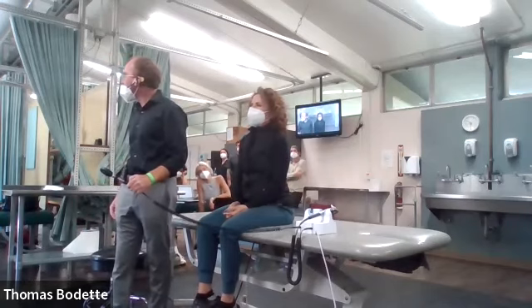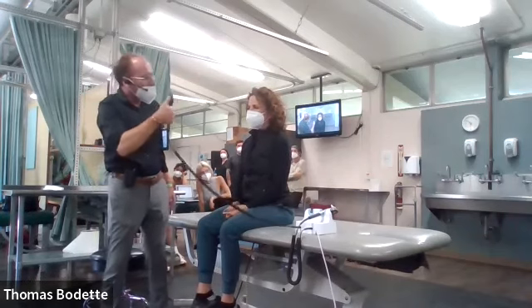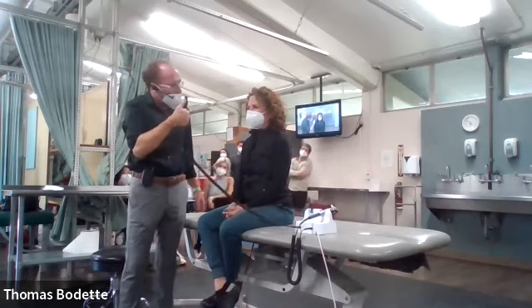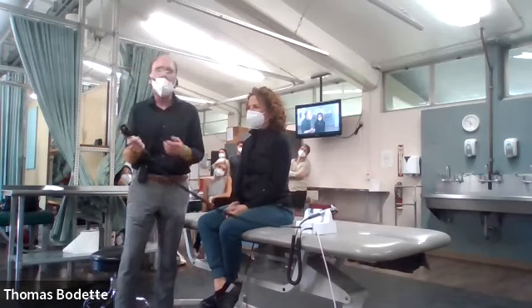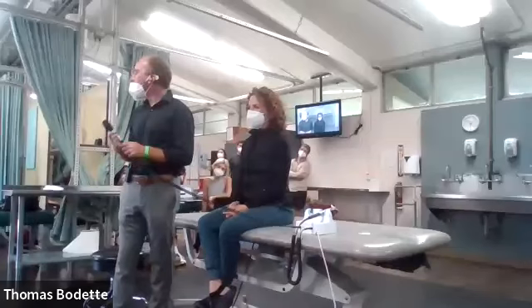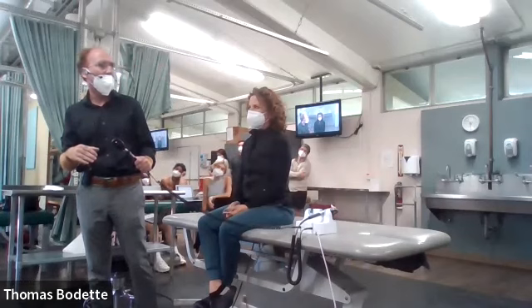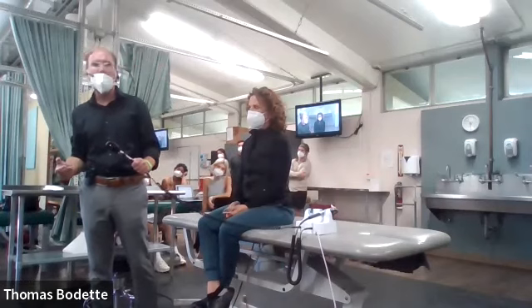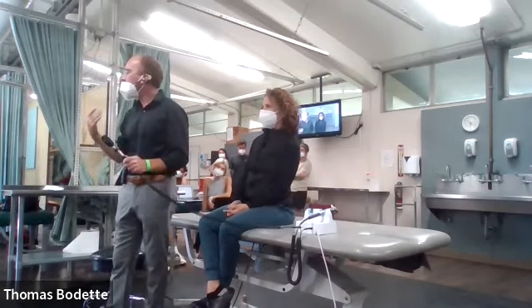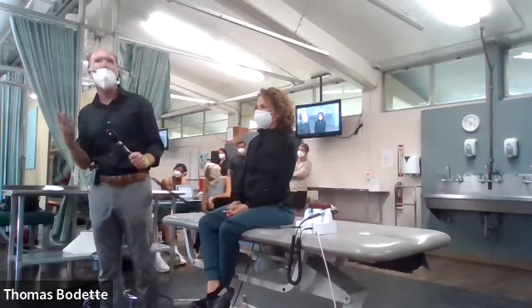So that's pretty much it. We're going to be looking for you to change focus coming from anterior to posterior. And since we can't dilate the eyes, if you're too far away or you don't move yourself around, it's not going to be feasible for you to visualize everything. Now, don't get me wrong, it's very hard for us to see exactly what you see on this exam. In fact, when I say very hard, it's almost impossible. So my advice to you is follow the steps as I just demonstrated, and based on your knowledge of what to look for, just make it look good.